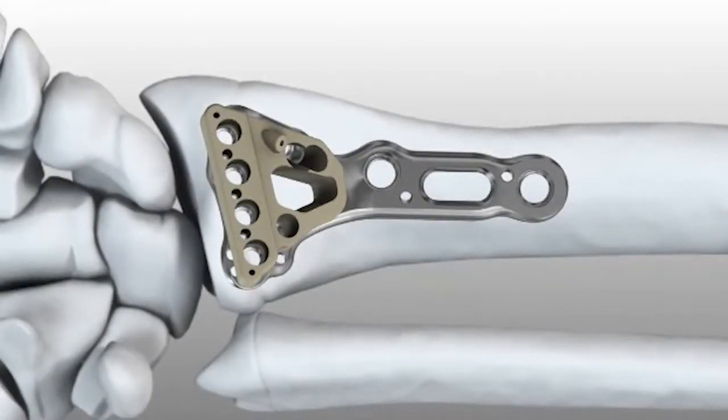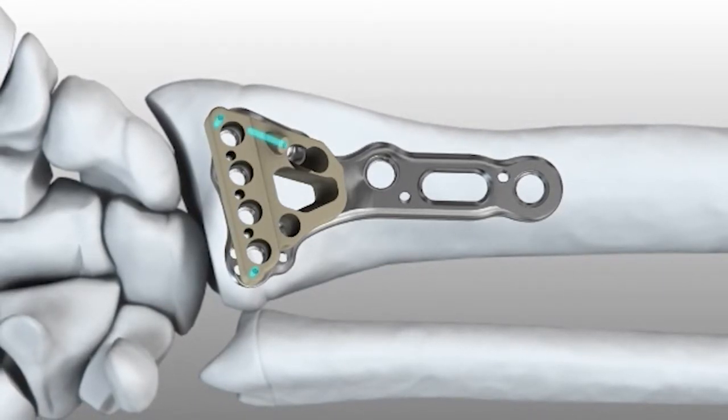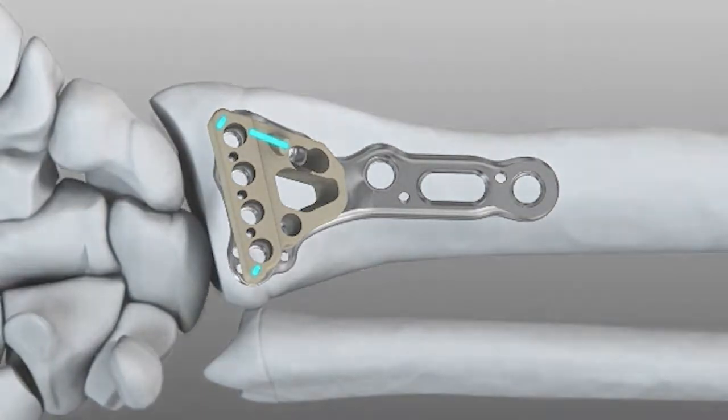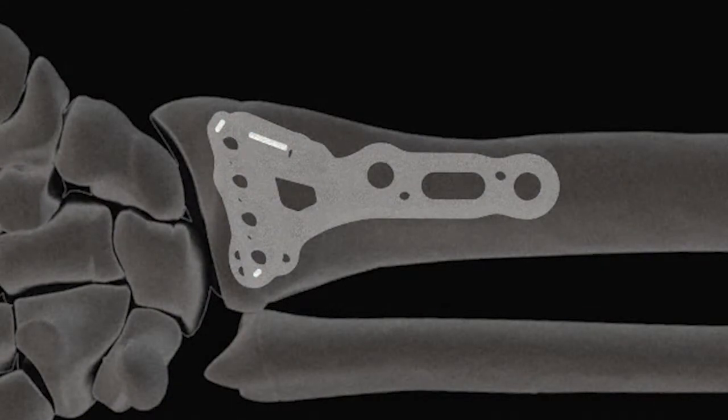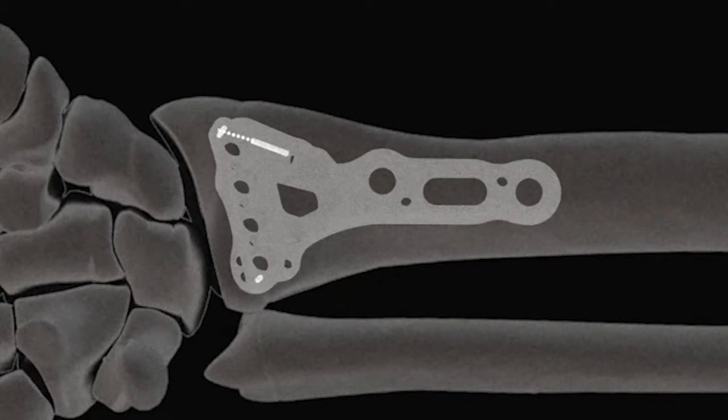Several instruments have been developed for the AccuLock-2 system to assist with plate placement. Radiopaque positioning posts have been integrated into the radiolucent targeting guides to assist with plate placement under fluoroscopy. To verify plate placement, a radiopaque styloid post is utilized in an AP view to project the trajectory of the most distal styloid screw. To align styloid screw placement, position the wrist under fluoroscopy in an AP view and adjust the plate so that the positioning post targets the styloid tip. This verifies correct trajectory of the styloid screw prior to drilling.